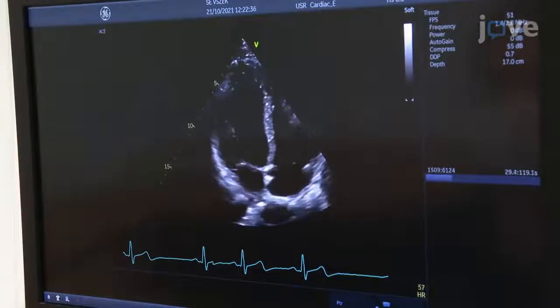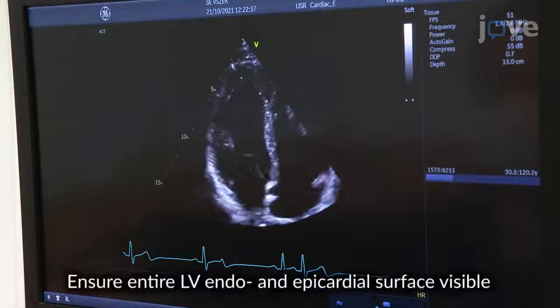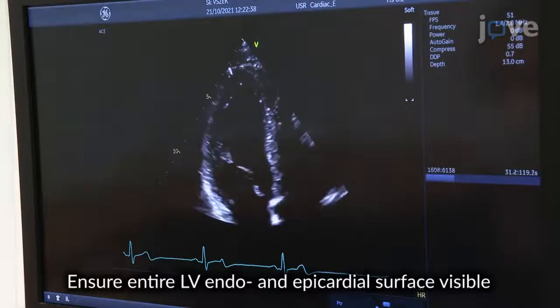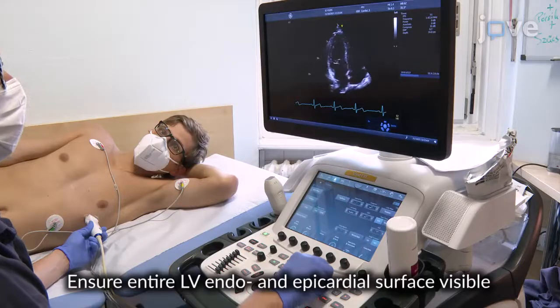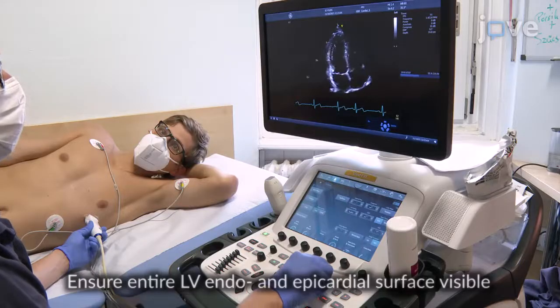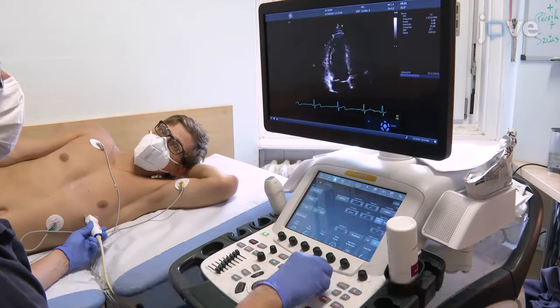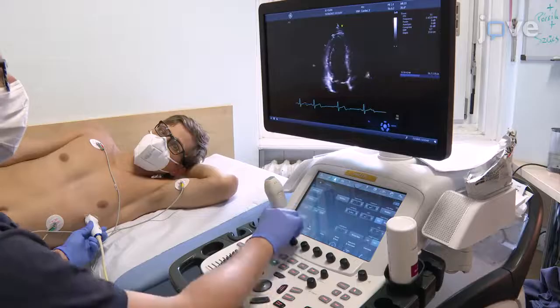To optimize the image quality, adjust the sector width to the left ventricle, lower the depth to truncate the left atrium, and use a slight overgain.